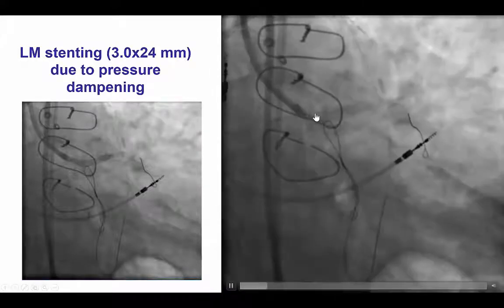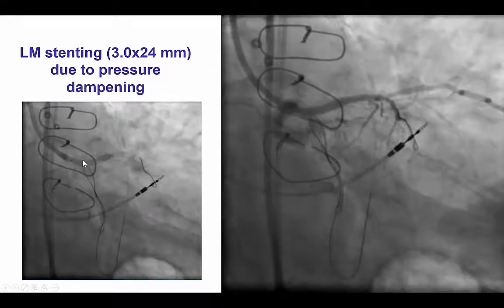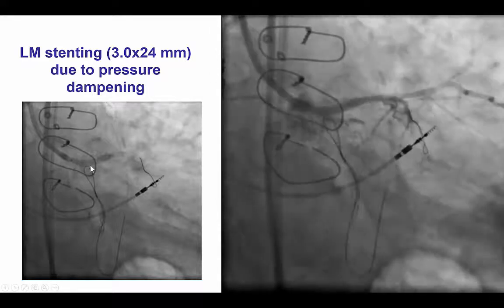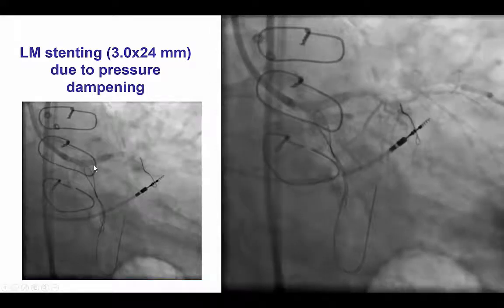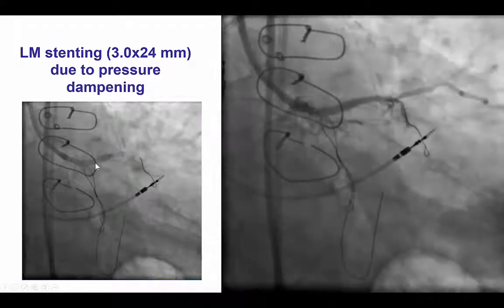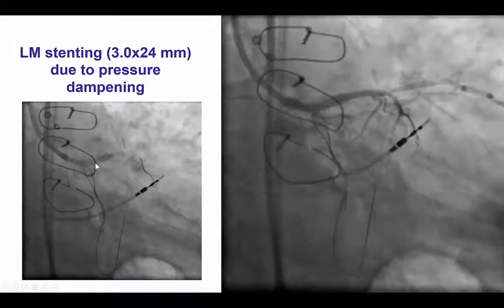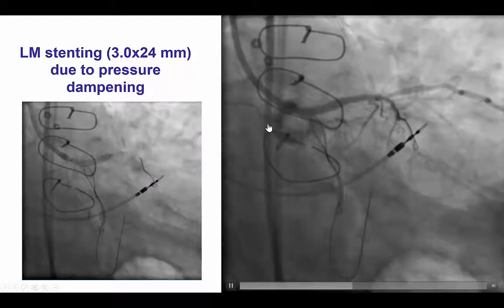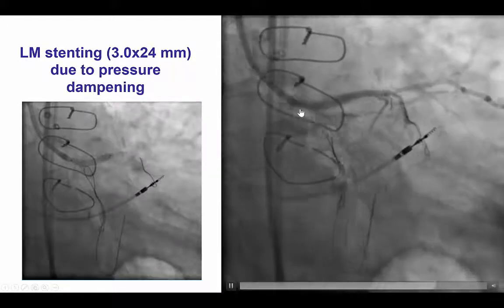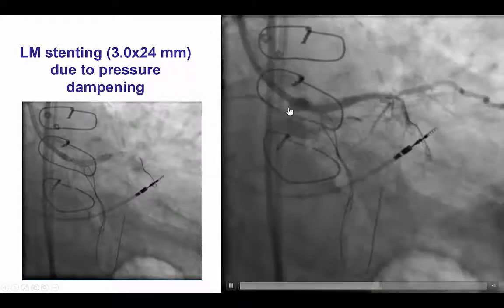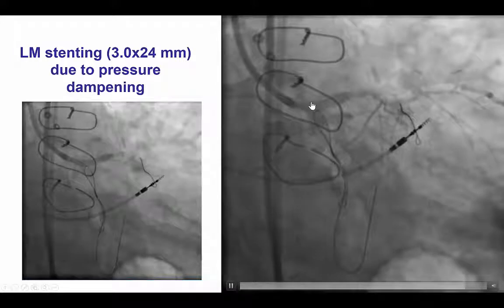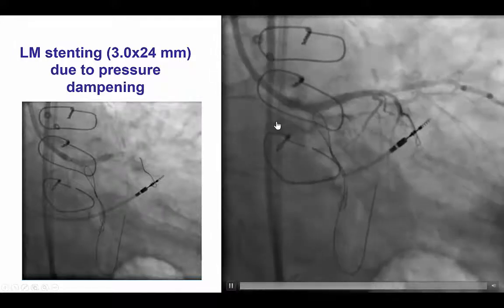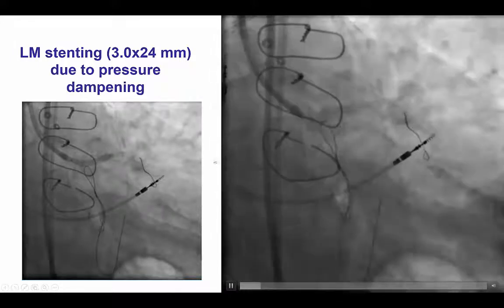In the meantime, the patient did have some disease in the circumflex that appeared to be getting slightly worse during these antegrade wiring attempts. That is why we decided to stent the left main to make sure we did not have any flow compromise, and that was achieved using a 3x24 mm stent.